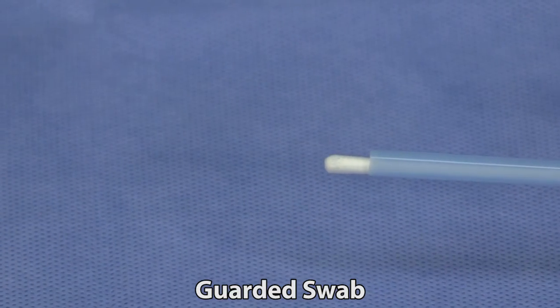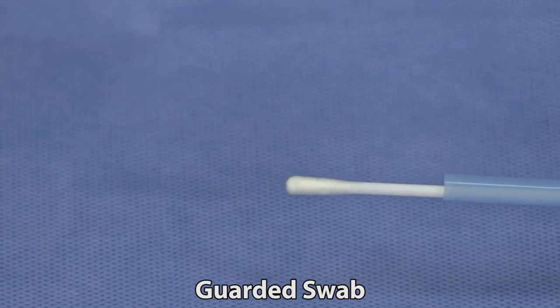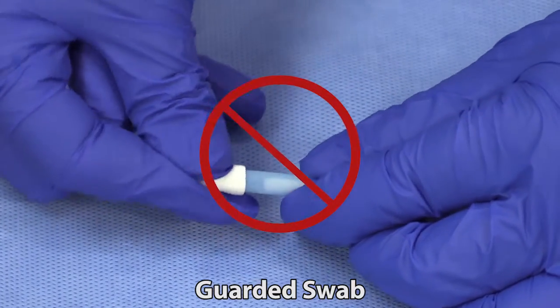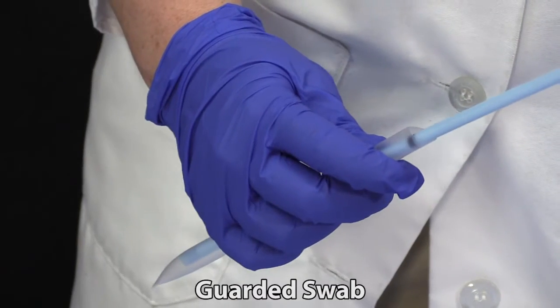This system allows for sampling a specific area without contamination from the surrounding areas. If a guarded swab is used, it should not be capped after collection. Rather, the swab should be removed from the guard and placed in the appropriate media.